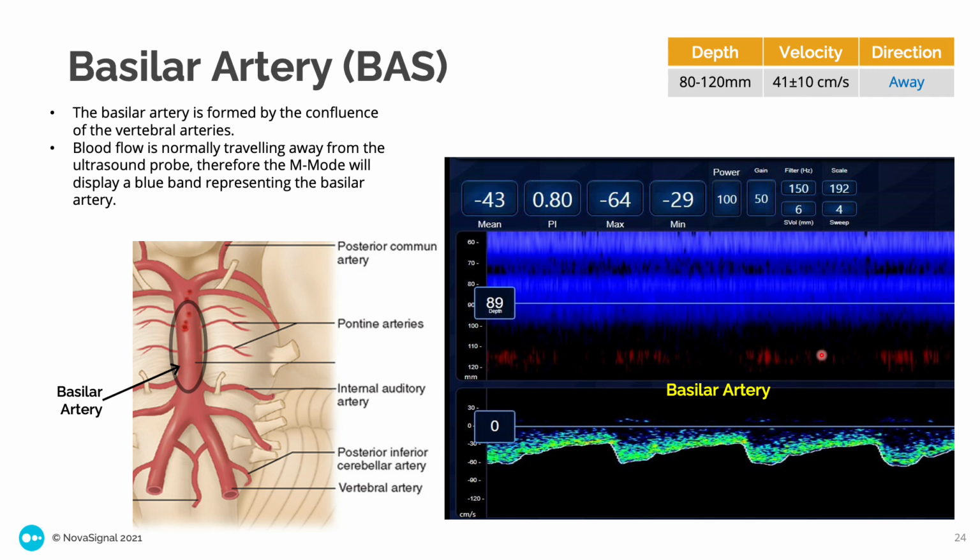Then when you move the sample volume there will be sound, and we will not go through that sense of panic and, oh my goodness, I'm going to lose my window. So it helps you stay more focused and stay at the same location.